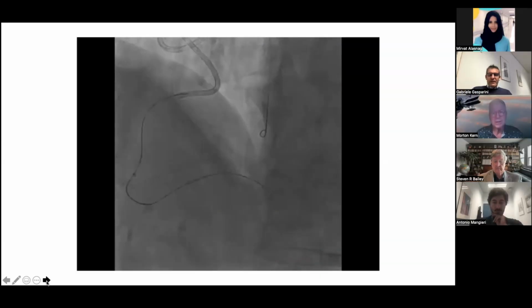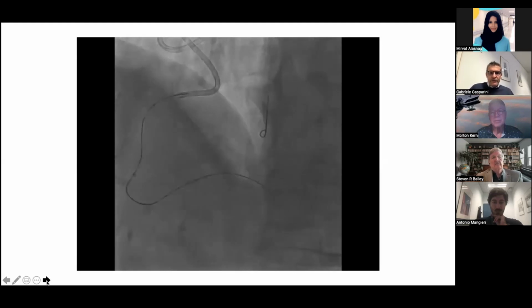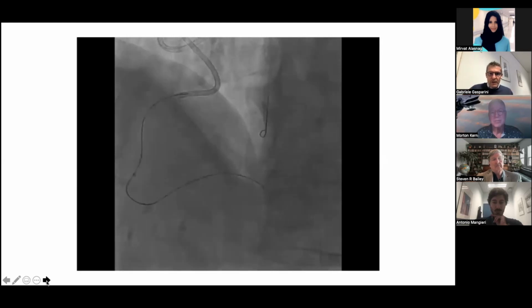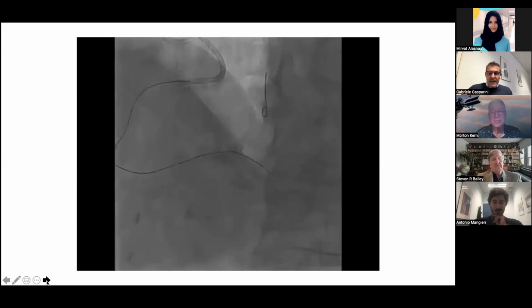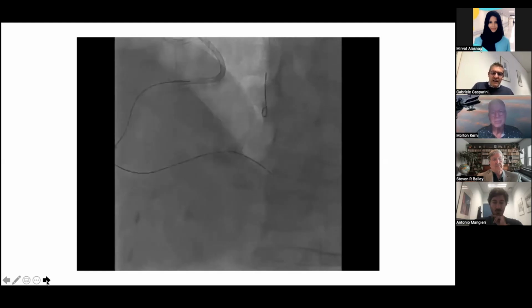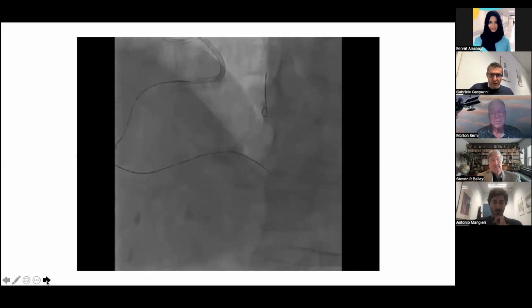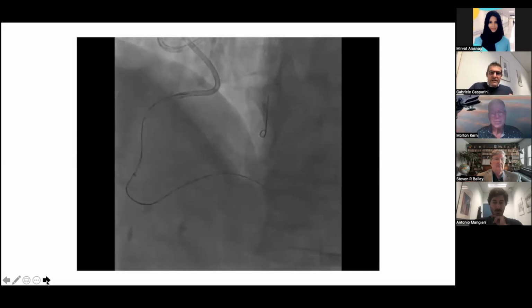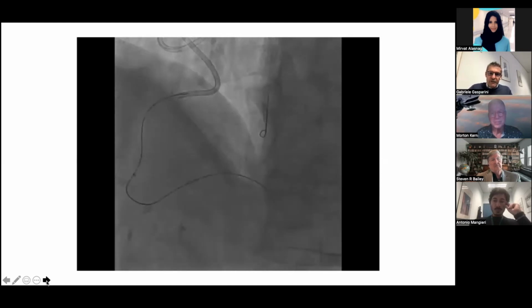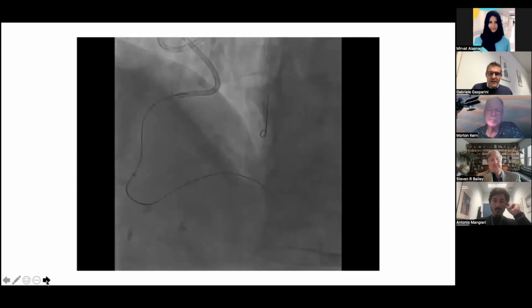So yes, this is a situation that can occur during a standard PCI. It was in this case an inadvertent rupture of the balloon. So it's something similar to the grenadoplasty, but it was not intentional. We inflated a small balloon into the very tight and calcified plaque, and we had an inadvertent rupture of the balloon. Of course, this rupture created a barotrauma with subsequent dissection. You can appreciate the contrast going into the subintimal space toward the PDA and the posterolateral branch as well.